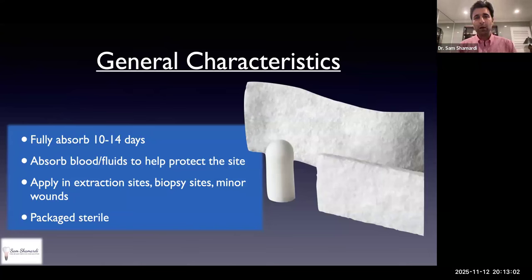because what these plugs are going to help us do is help us wick that bone and get very good clotting for those first 2 weeks of that extraction socket healing. So it will provide protection over the socket and the graft that we have put. It will help with our overall clotting, and of course, it will resorb all on its own.